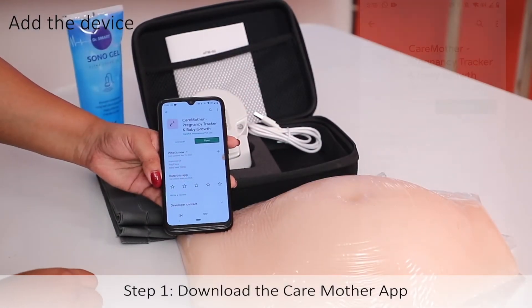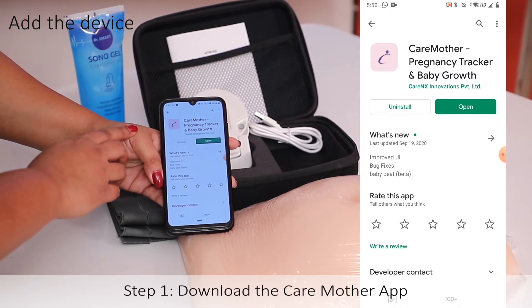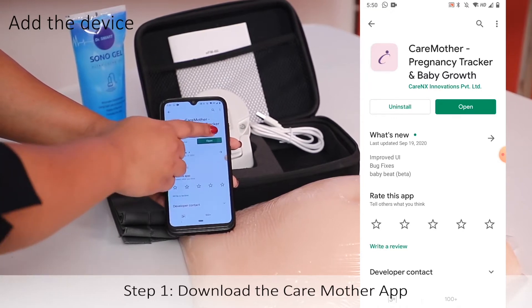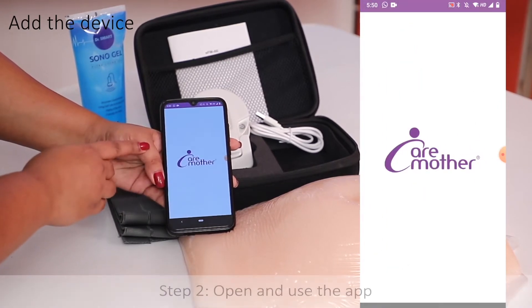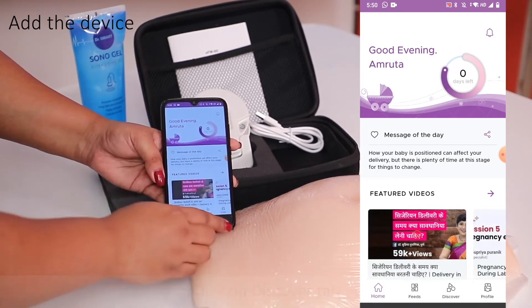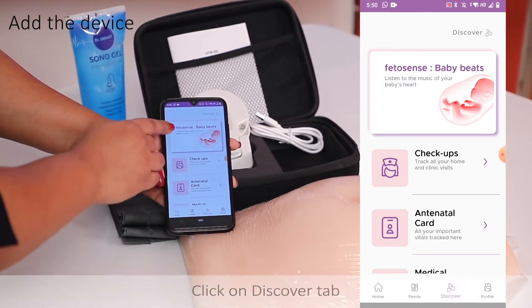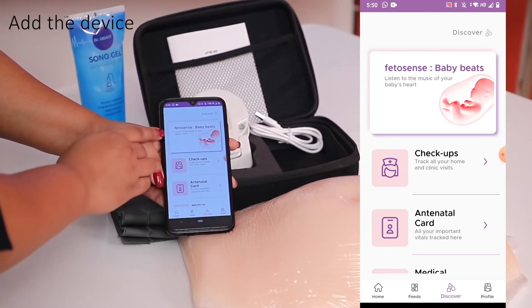To use this device, first of all download the CareMother app from the Play Store. Once you have downloaded the app, open it. You will have to click on Discover, and then come to fetosense Baby Beats.